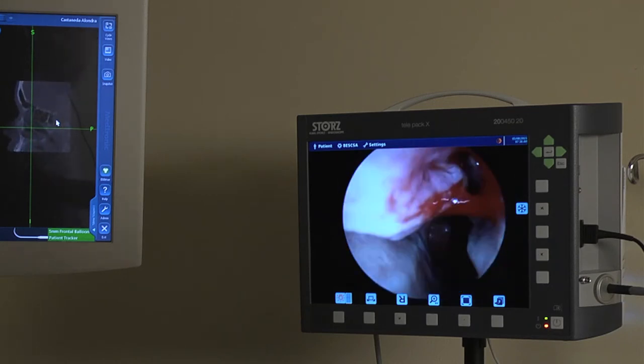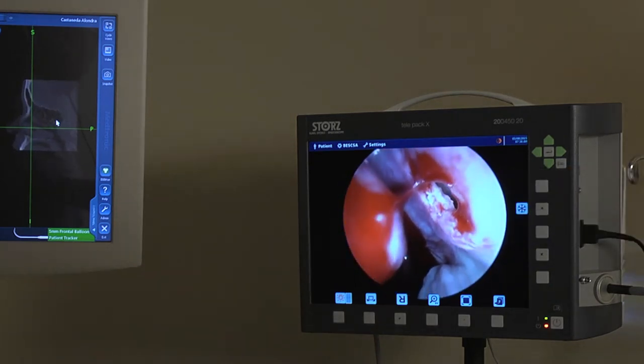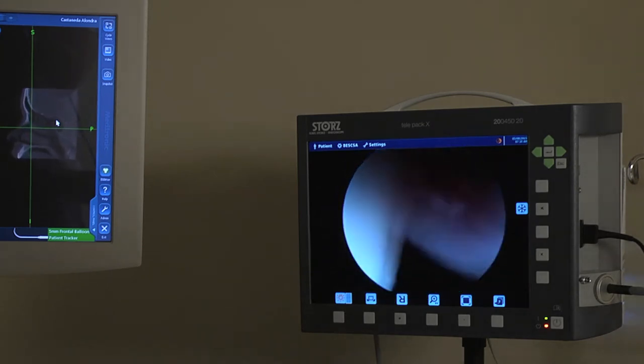And there is the hole. I'm going to get around that little drop of blood. There's the hole right there — a new hole into the sinus, which will prevent buildup of pressure and stop infections.